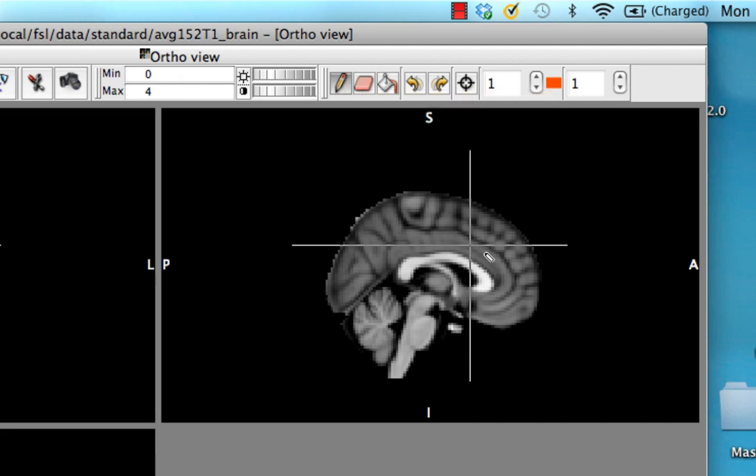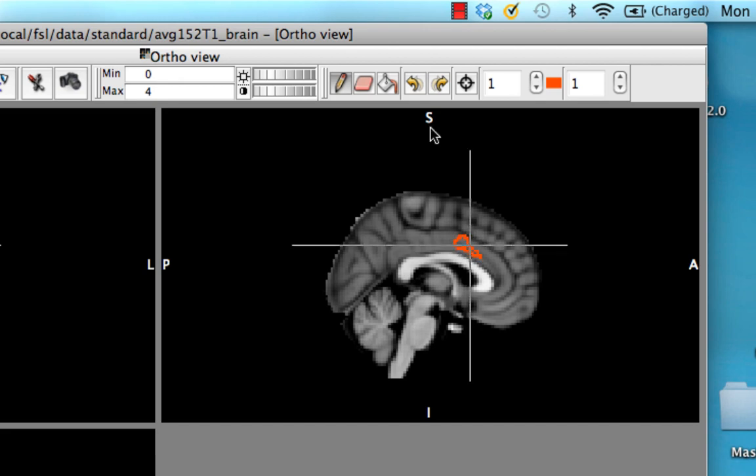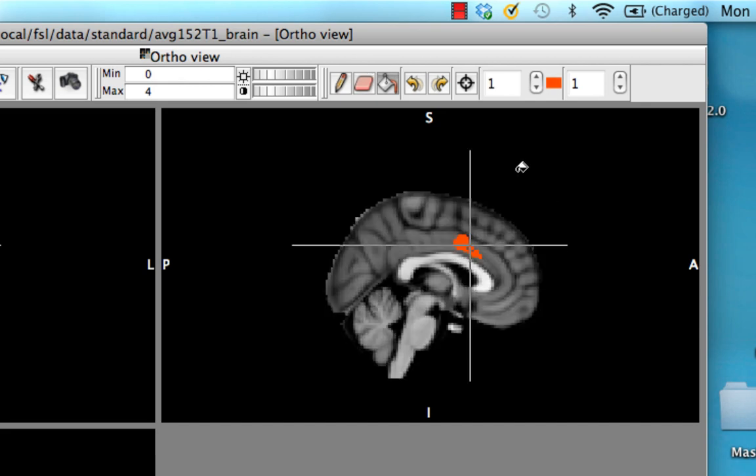To show you how this is done, let's say we want to create a mask of the anterior cingulate cortex. We can draw this pen around here. We could create a bigger circle, for example, or use a bucket just like MS Paint and fill that stuff in. If you screw up and go outside, then the whole thing gets plotted out. I'm sure you're all familiar with that, but you can undo it.